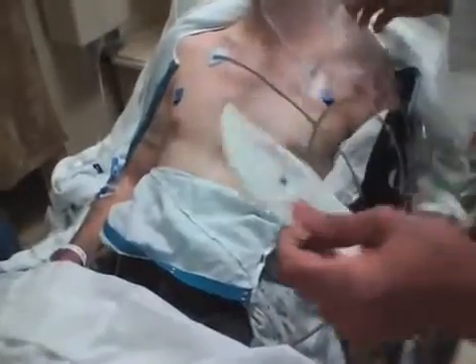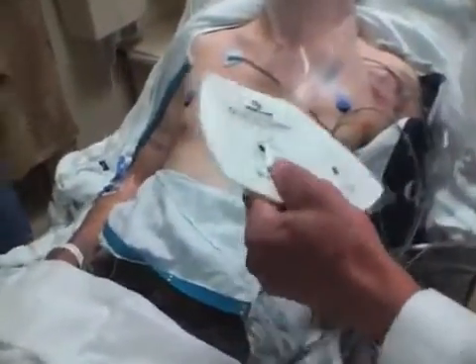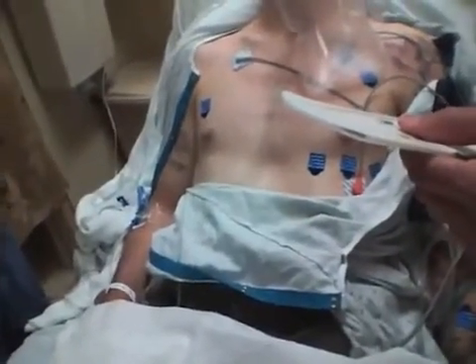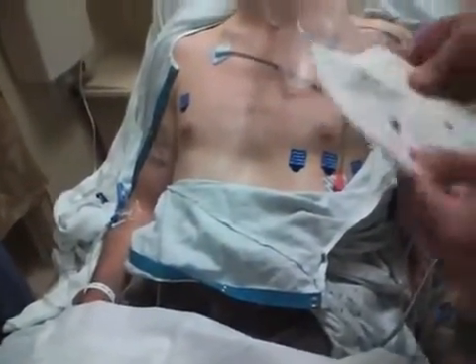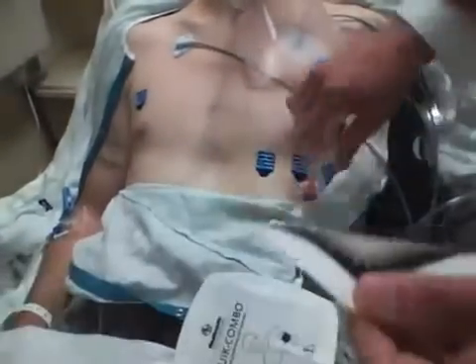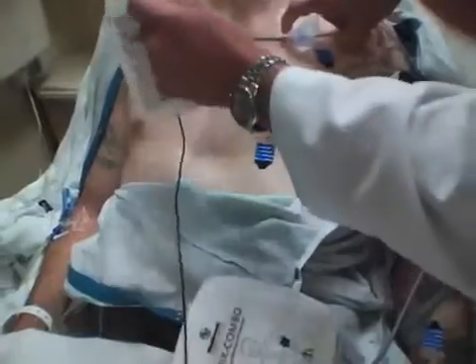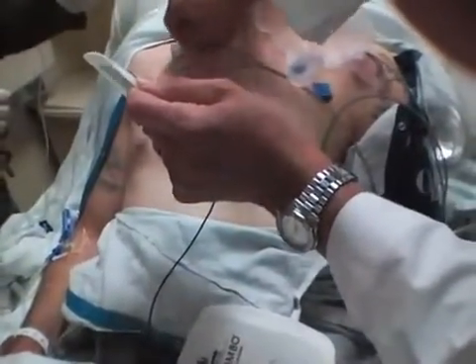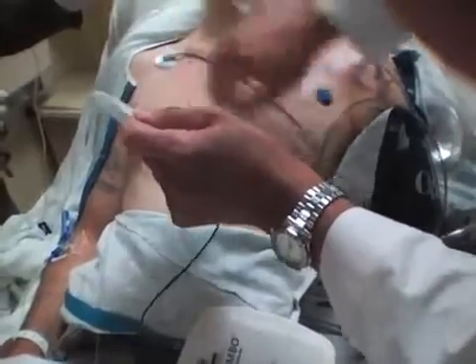To begin the process, the patient is placed on a cardiac monitor and intravenous access is obtained, just as with any other cardiac patient. The discharge is delivered through stick-on pads in most patients, although the normal paddles can be used if these pads are not available or do not fit onto your cardiac monitor defibrillator system.